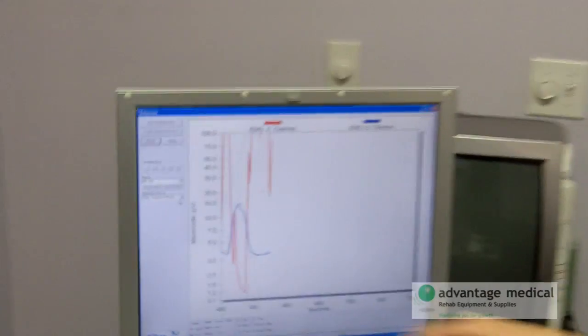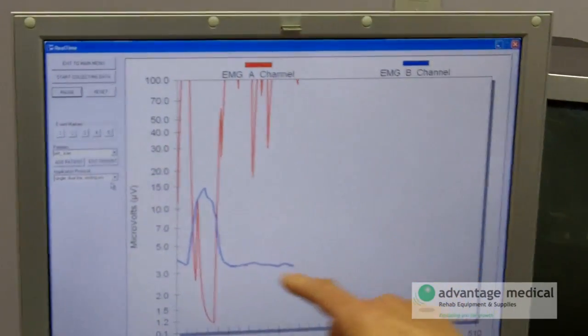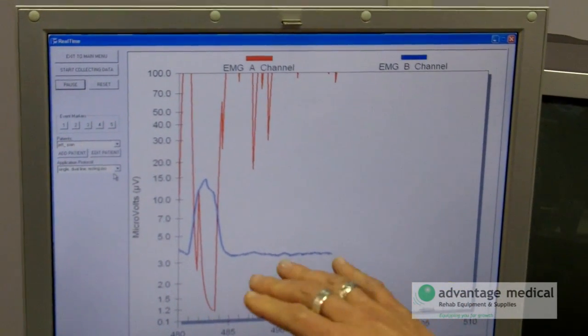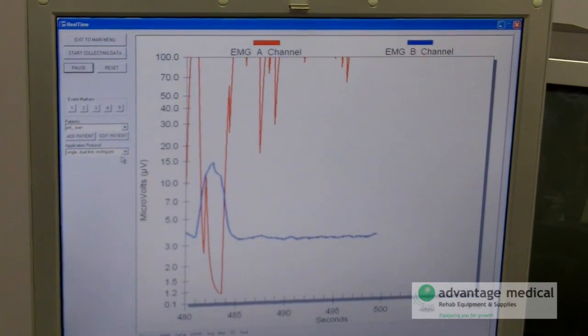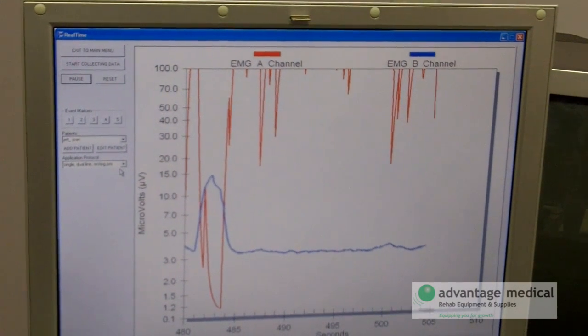The biofeedback then gets connected into the computer. And as you can see on the screen, you have the red line — the red line is the weak muscle, the pelvic floor muscle. The blue line we have connected to your belly. We want to make sure that the blue line is not working during this exercise. So the first thing I want to see you do is cough, to make sure that the biofeedback is in place properly.